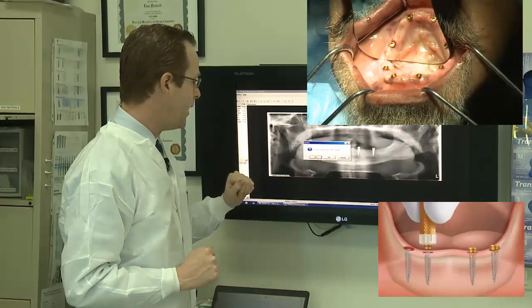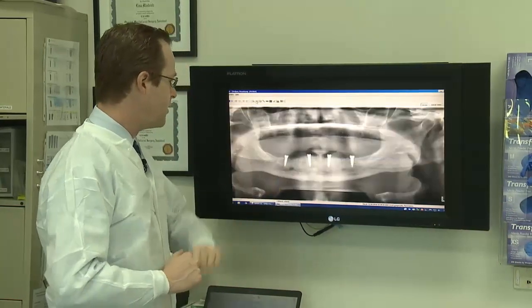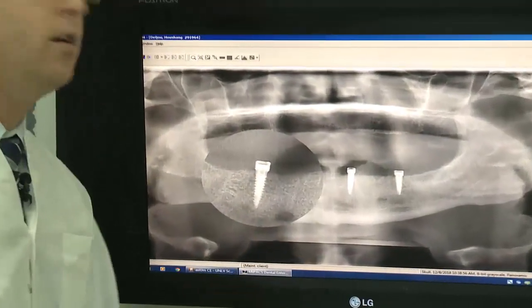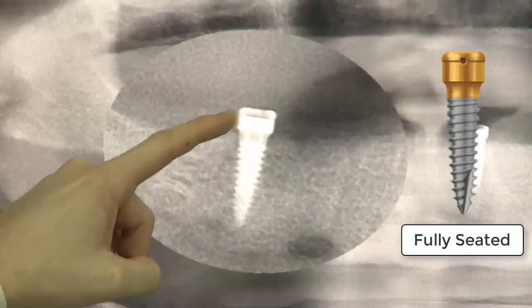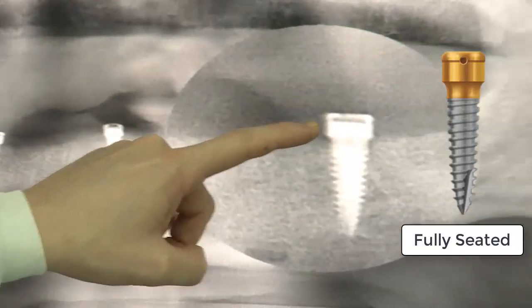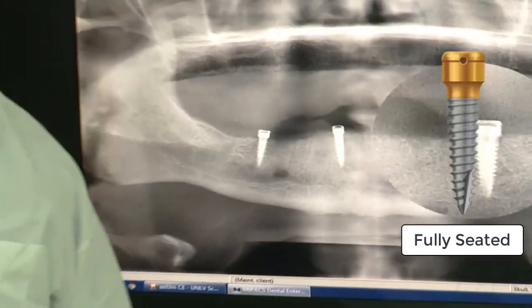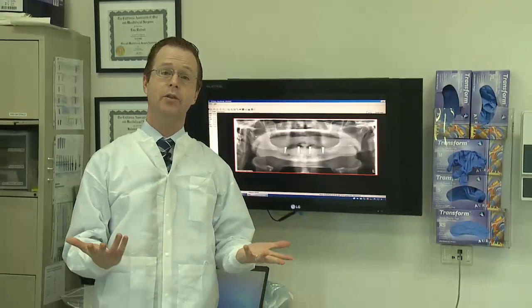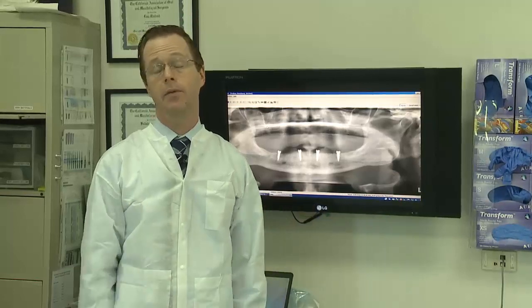Now, blowing that up and using magnification on 19 and 30, you can see the abutment is fully seated — everything looks appropriate. There's no gap visible at the junction on 19 or 30. Rolling up and down right here, we have a perfect seat. As you can tell, the dynamic nature of flapless surgery makes it a bit more of a blind surgery, but Dr. Engel showed off some really beautiful surgical skills here, and we have a fabulous result.